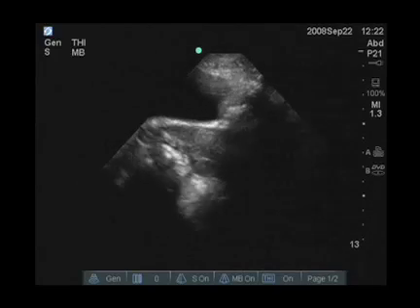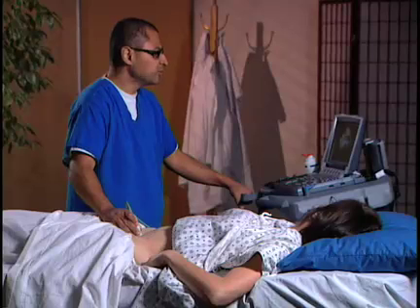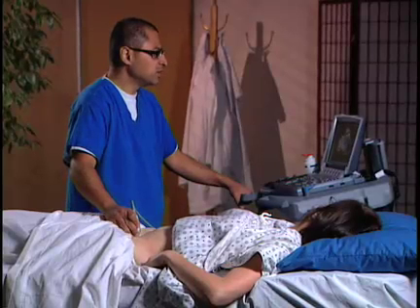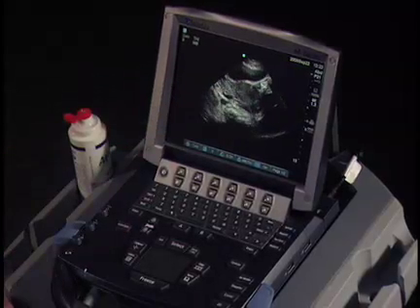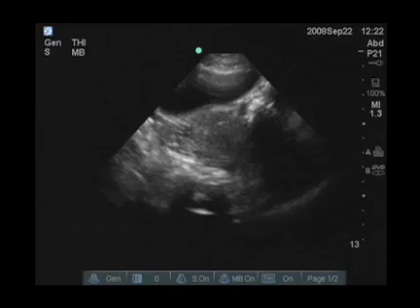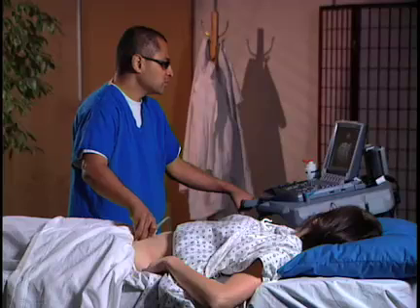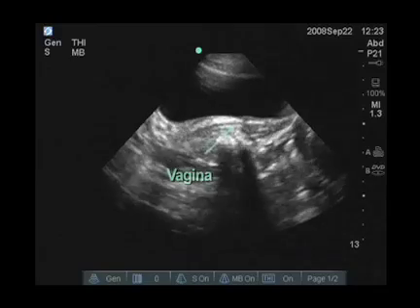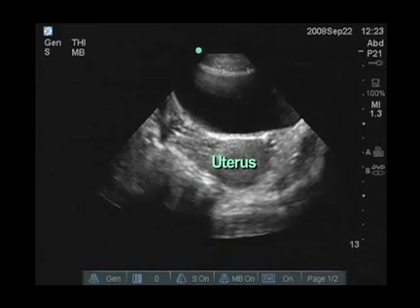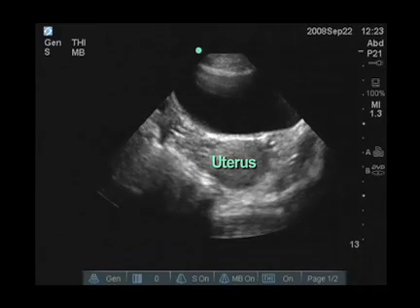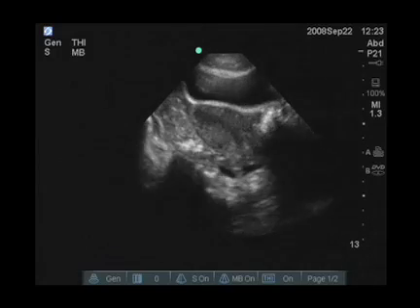In between, we're also going to identify the uterus. So we're going right to the very top of the bladder to about mid-bladder. We can see the uterus here in the center, and a very small amount of free fluid here, which can be physiological as well. We're scanning all the way inferiorly to more superiorly — we see the uterus, we actually see part of the ovary there, and then we're going to go all the way more superiorly.